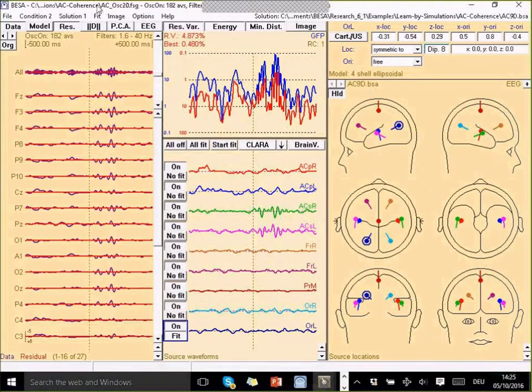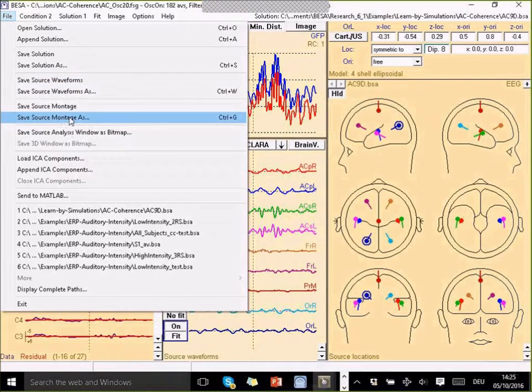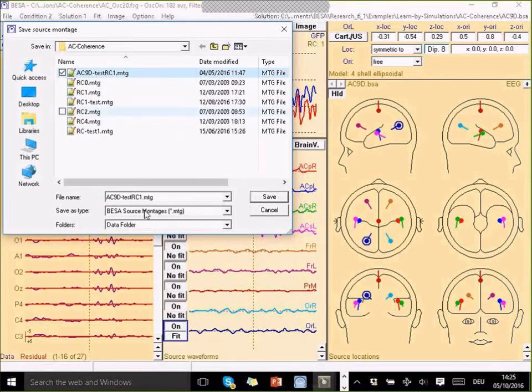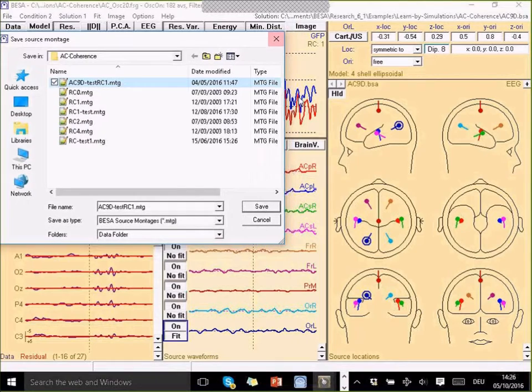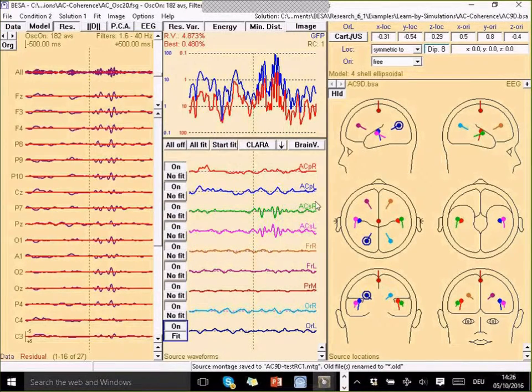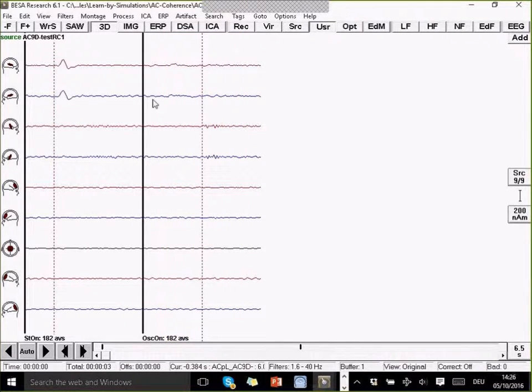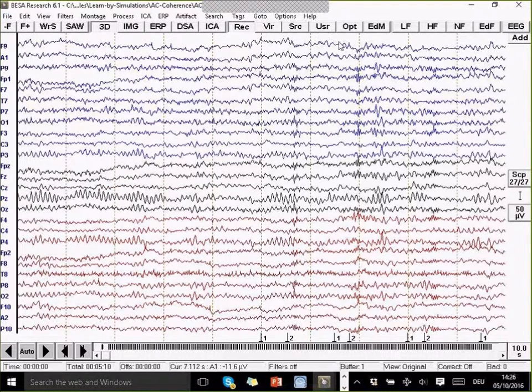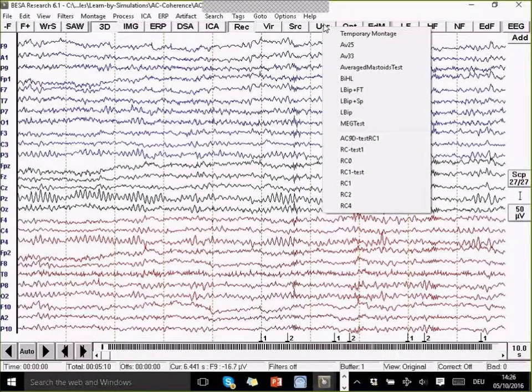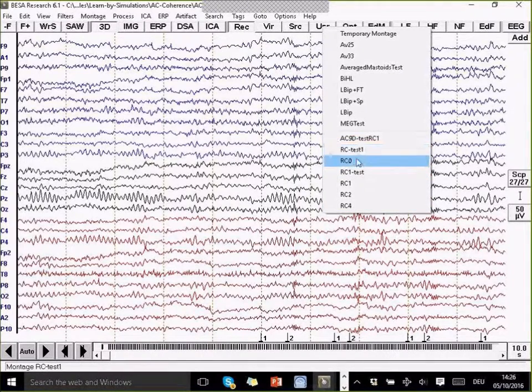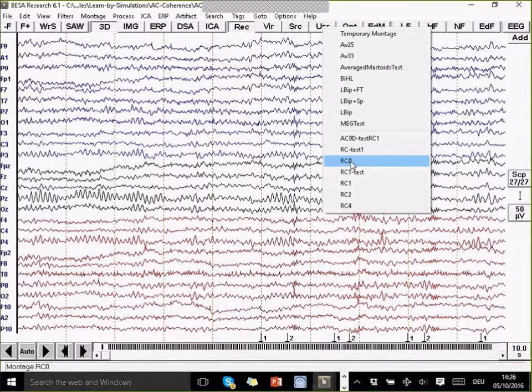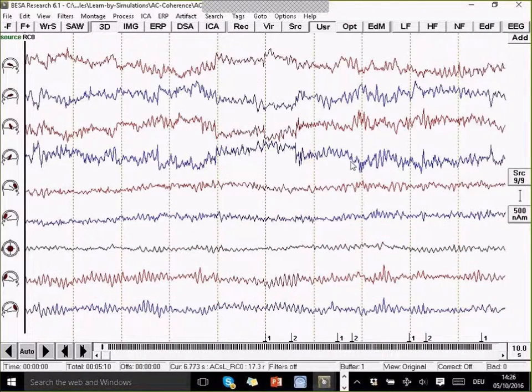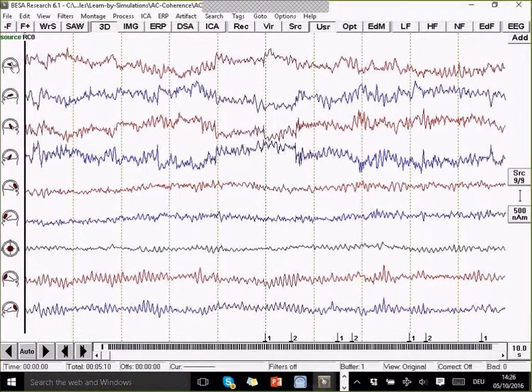So if I now apply this to the data, I'm going to save this as a source montage solution. I'm going to call it AC9D-testRC1 because it's got a regularization constant of one. Then immediately my data set here gets transformed into the source montage. If I go back to my AC_Osc20, I can also pick this source montage from the user button. But I'm now going to work with the rc0. It's the same source montage, it just has a regularization constant of zero.